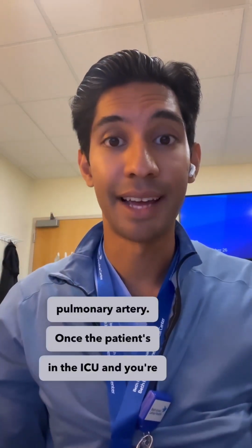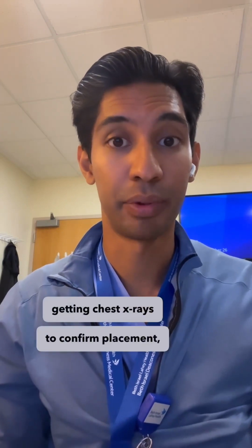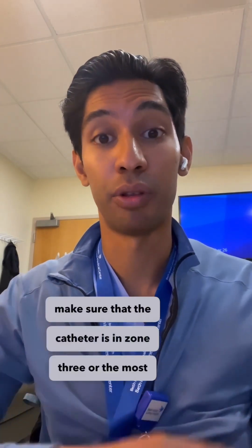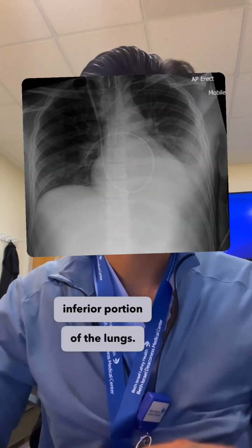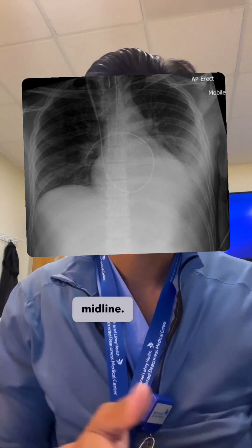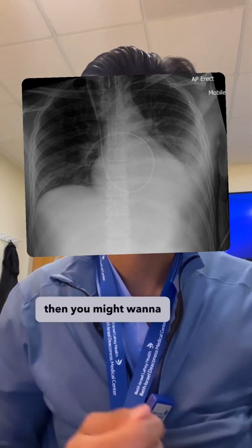Once the patient's in the ICU and you're getting chest x-rays to confirm placement, you basically want to make sure that the catheter is in zone 3 or the most inferior portion of the lungs, and then you also don't want it going past 3 to 5 centimeters from midline. If it does go past that far, then you might want to withdraw your catheter.